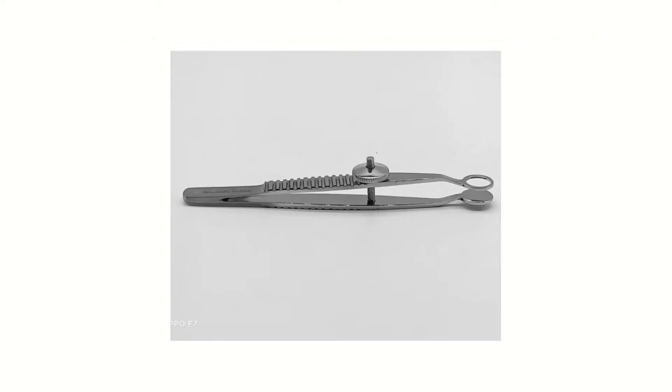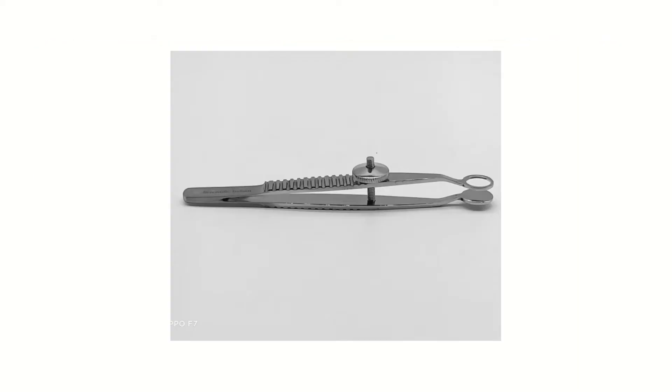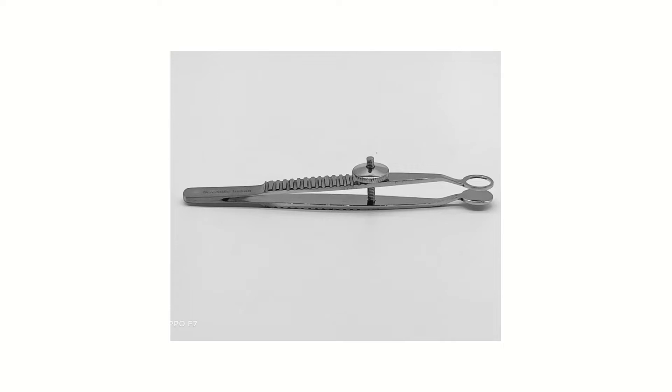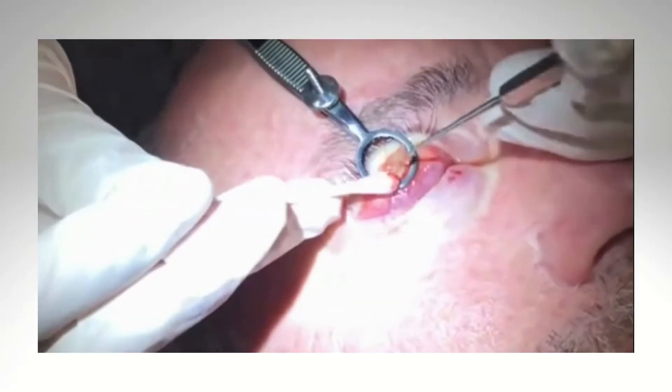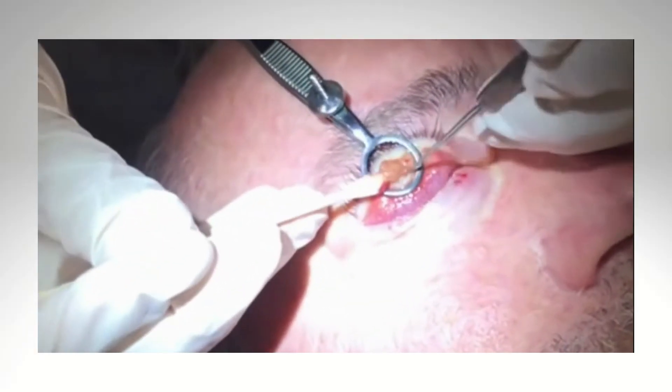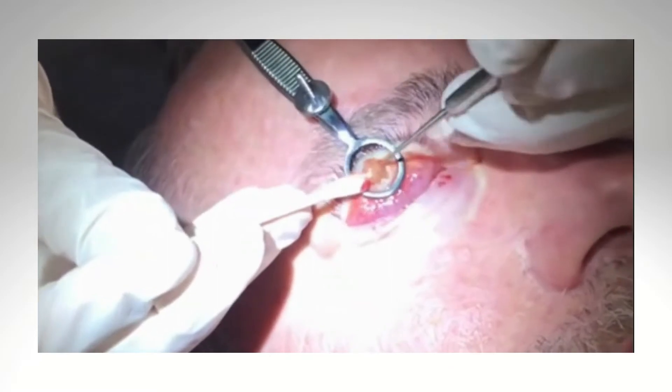A soft screw mechanism helps to avoid overtightening of the blades, which would result in tissue damage. It also prevents frequent eyelid slipping during the surgery.